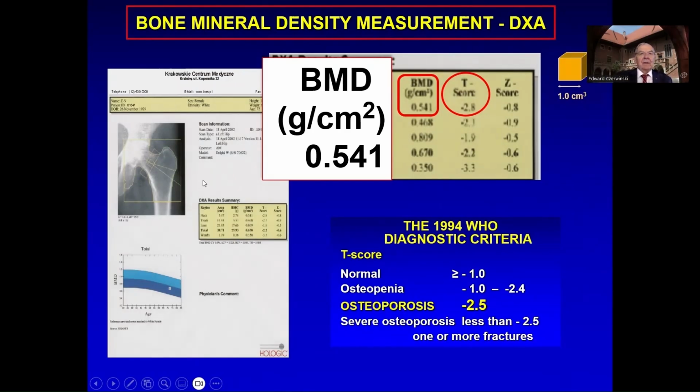Please note that results are in grams per square centimeter, bone mineral density per square centimeter.